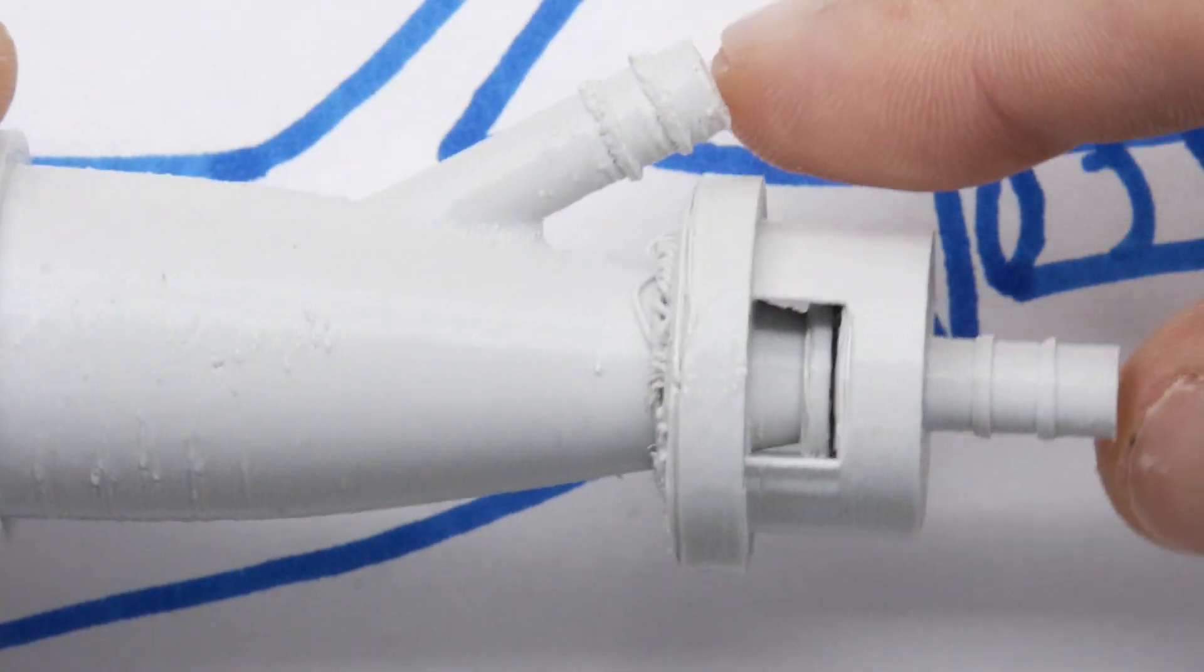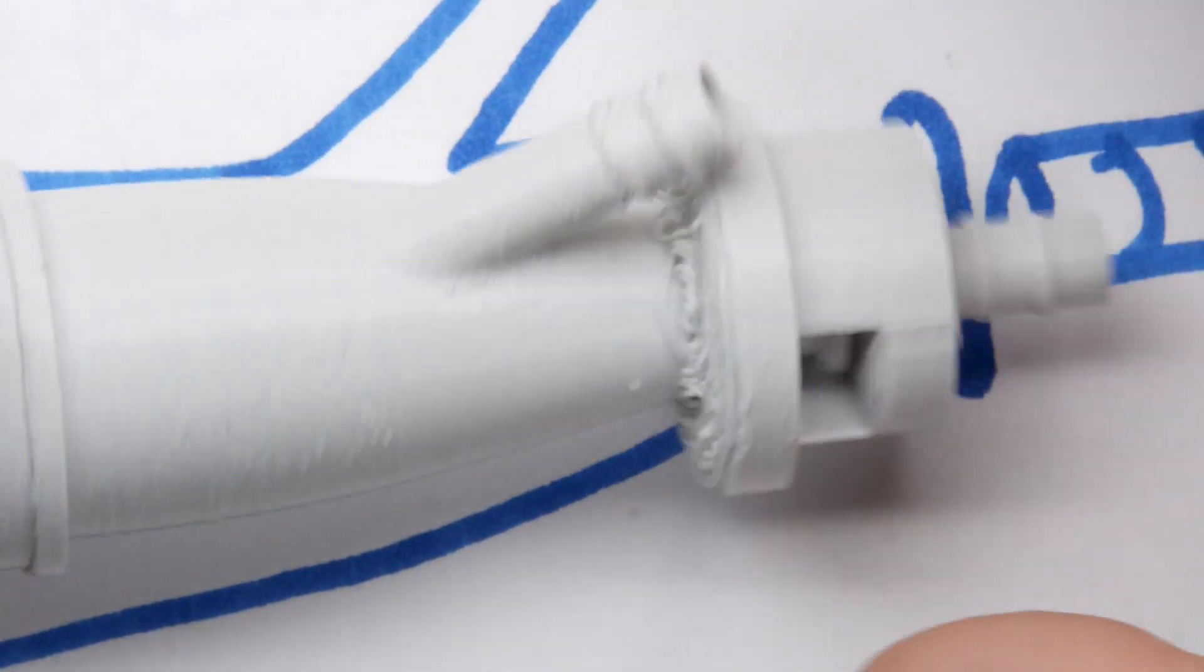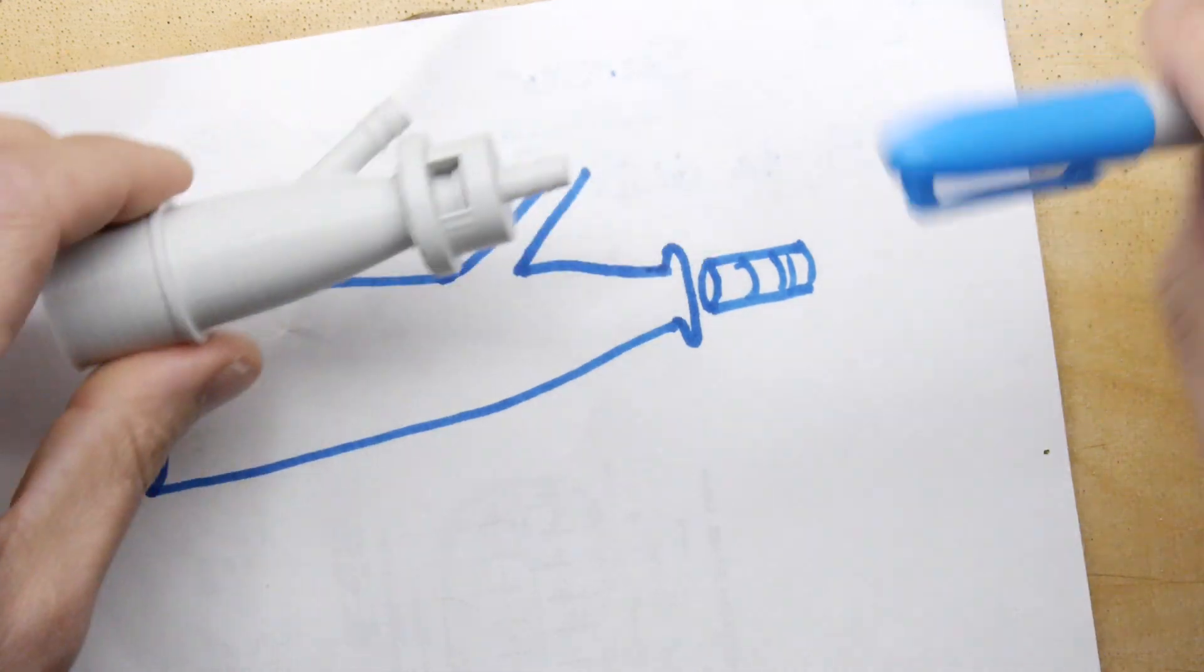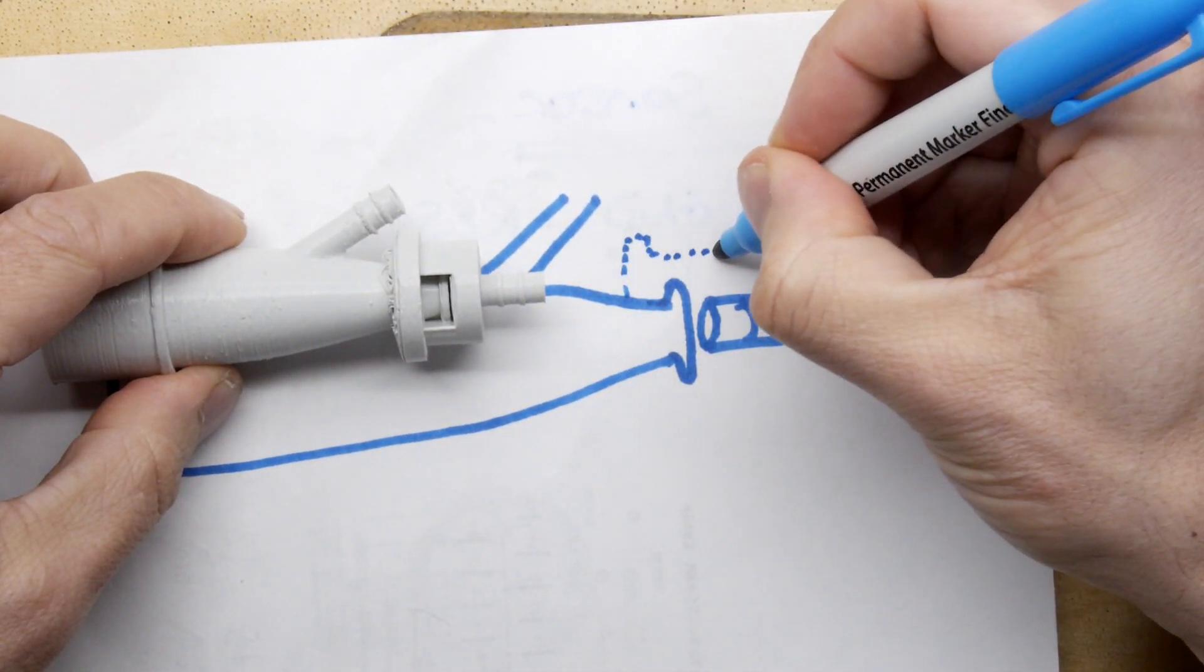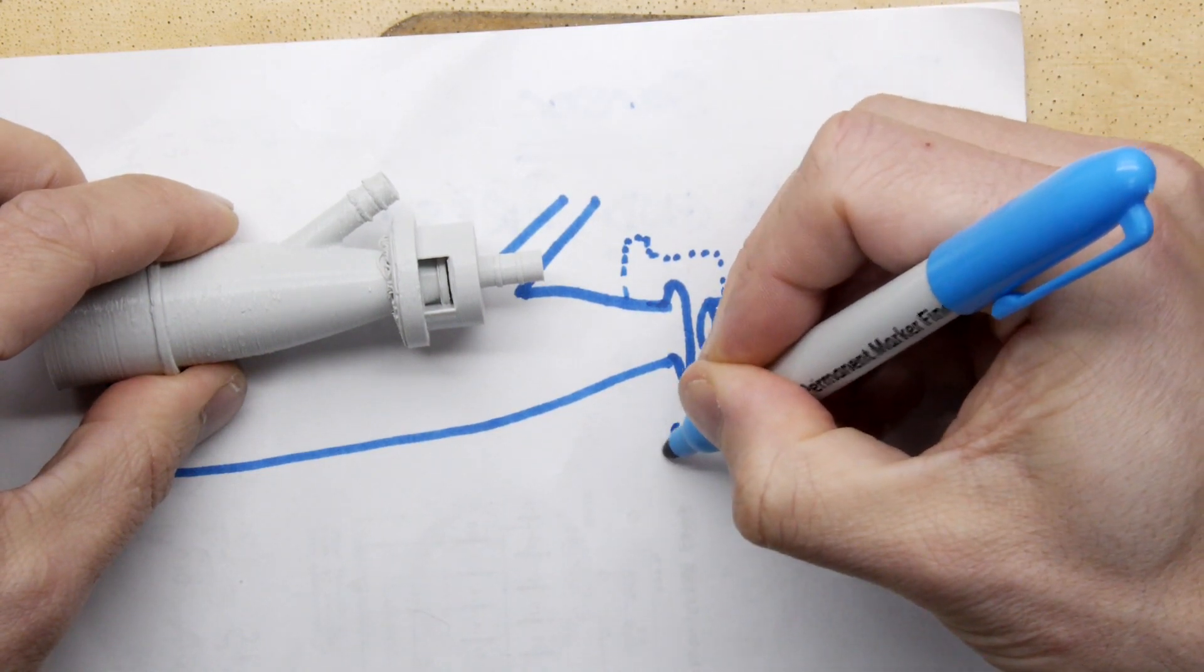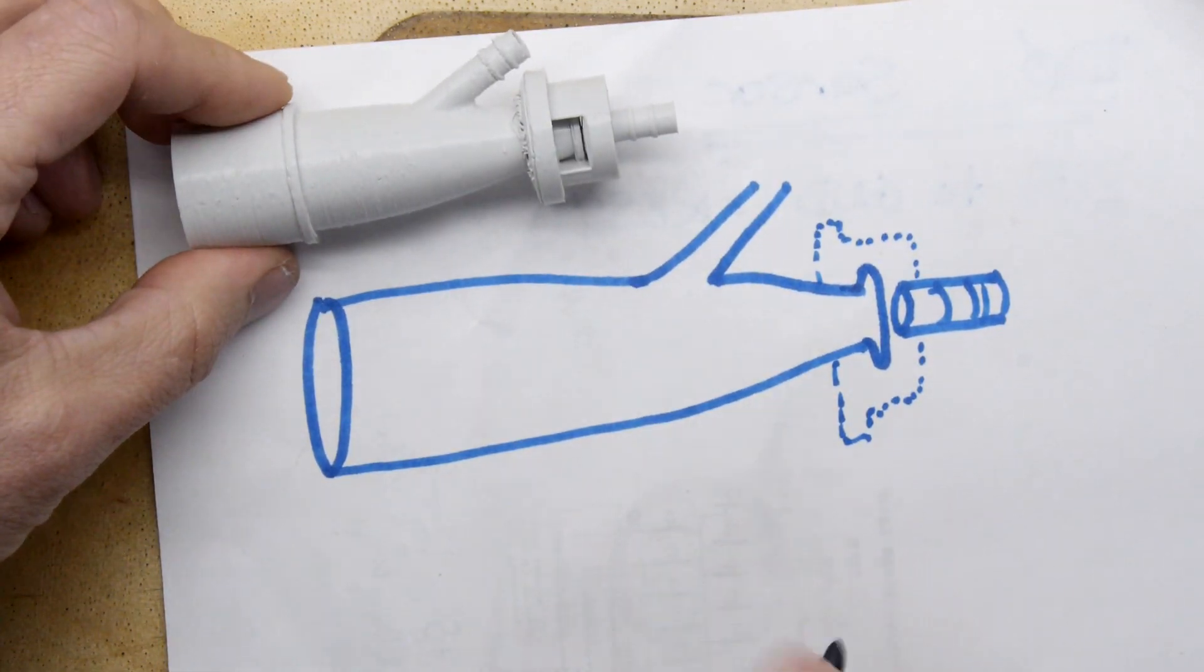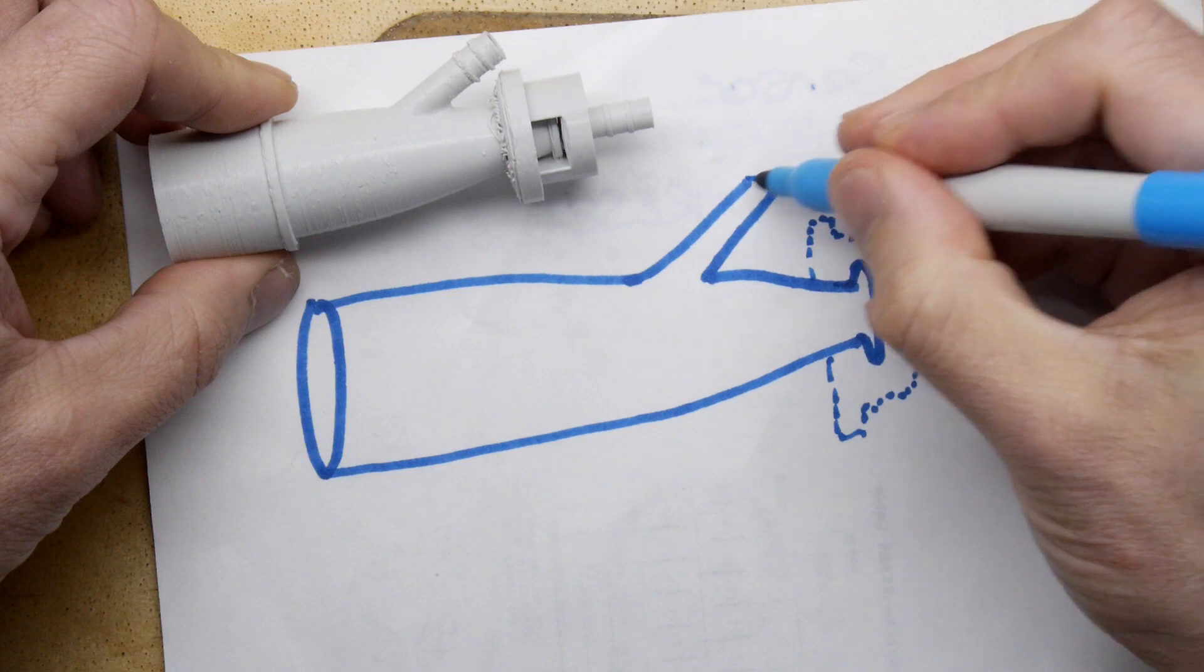Even if you blocked all of these ports and blew into it, you'd still have gas coming out these sides, so it can breathe from there. All I can assume is this is on its way to or from something.